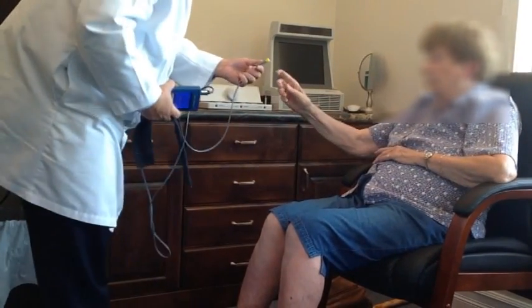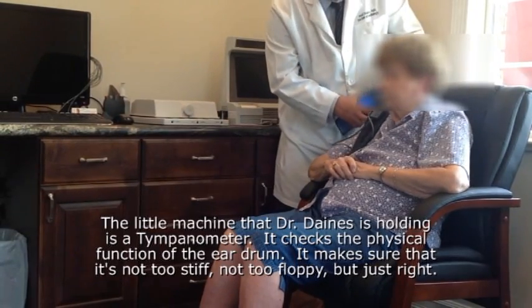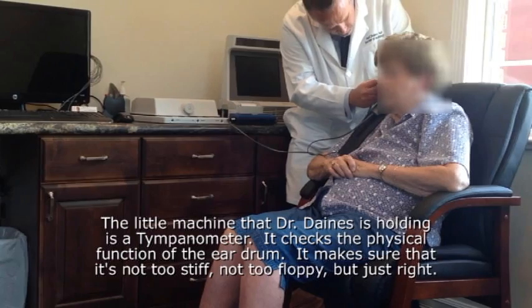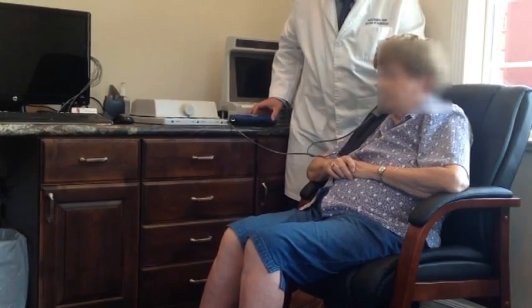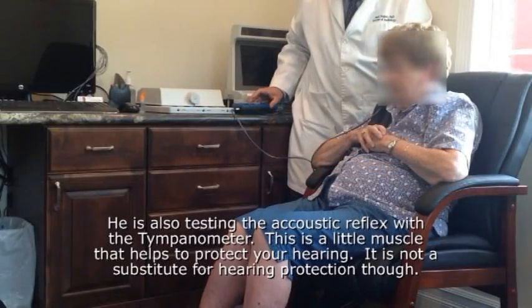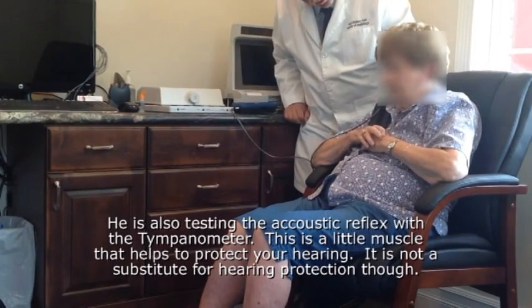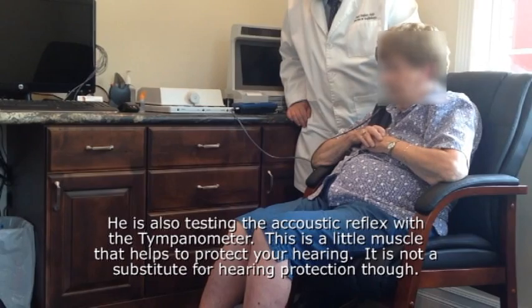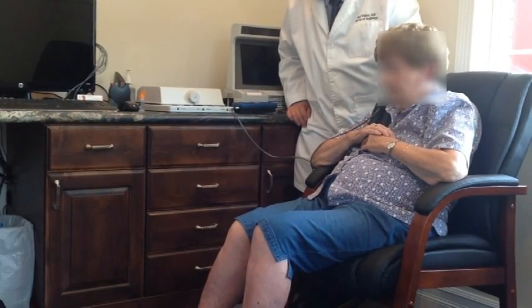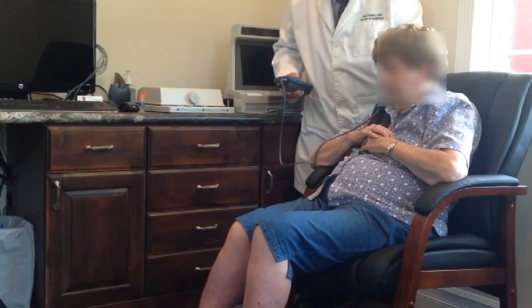This is that soft tip. I'll just put it in your ear. Set this right here. You'll feel a little bit of pressure like you're going through a canyon and hear a few beeps. Now you're going to hear a series of beeps. Now let's switch to the other side.